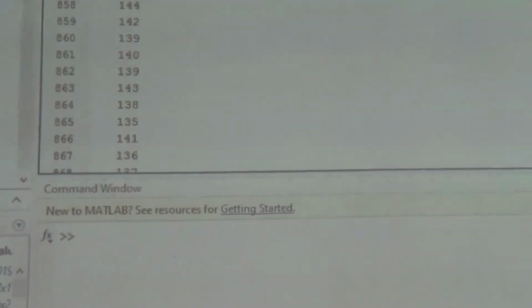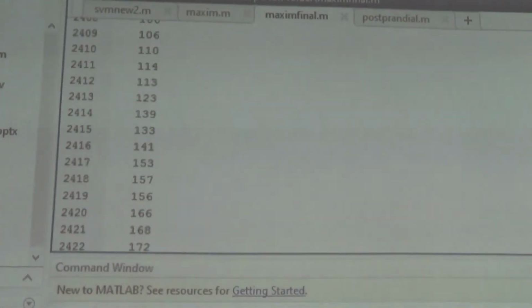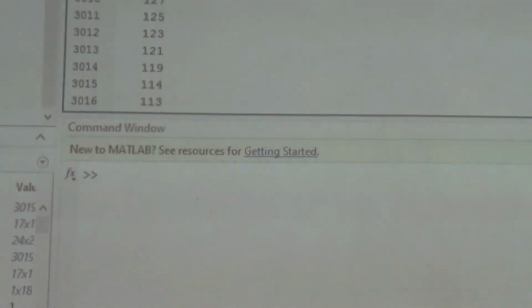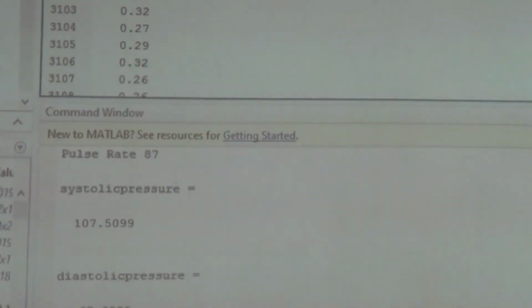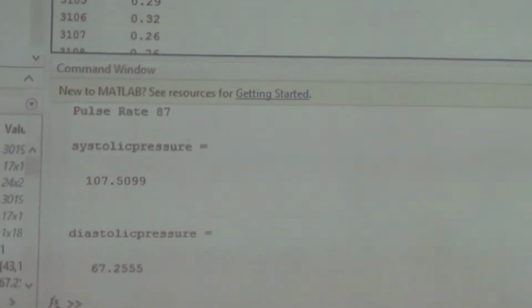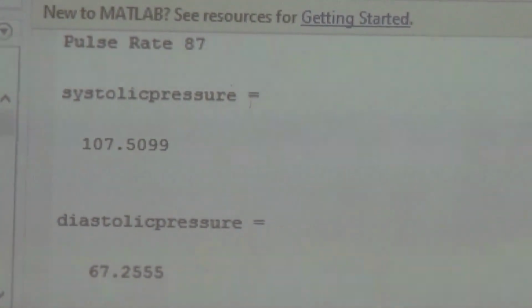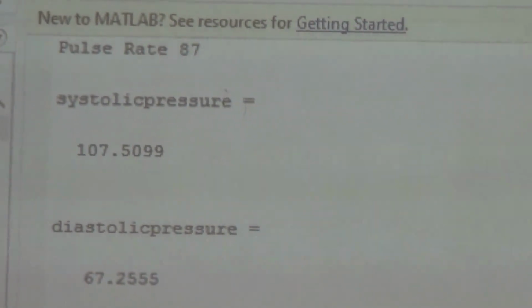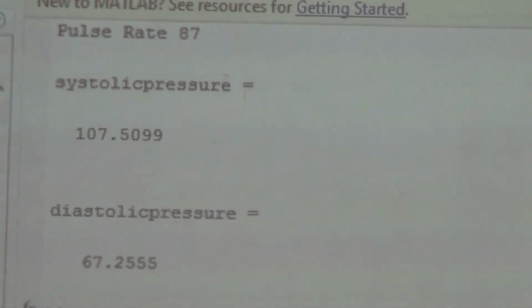The ADC converted PPG data is taken to MATLAB for further processing to derive blood pressure, pulse rate, blood glucose and SpO2 measurements. A dataset is formed for the prediction, which takes the reading invasively for comparison using a clinical device. Blood pressure and pulse rate measurements are obtained using support vector machine algorithms. These are the systolic and diastolic pressures we have obtained with plus or minus 10 mm Hg error and a pulse rate with an error of plus or minus 5 units.